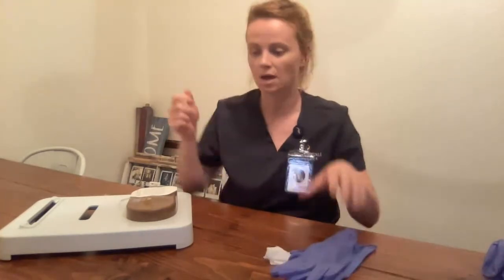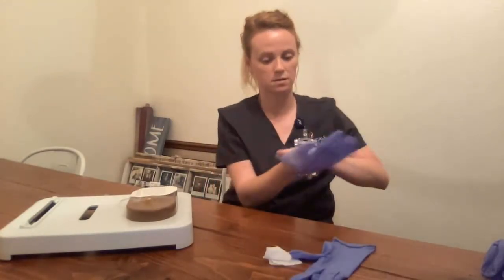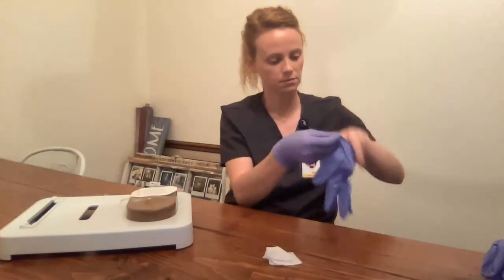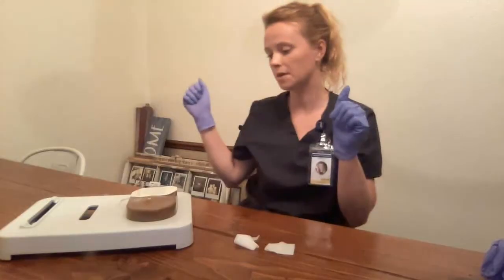I'll leave my patient's room. I'm back. I'm going to discontinue the IV. I have my supplies, my gloves. I'm going to do hand hygiene. Apply gloves. I have two gauze and my tape.